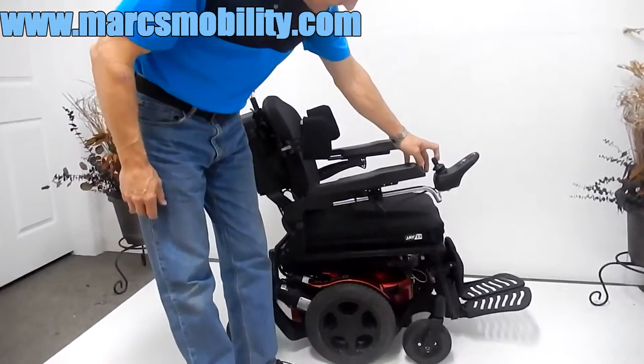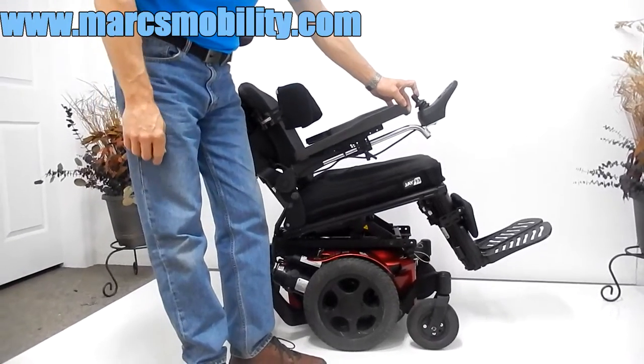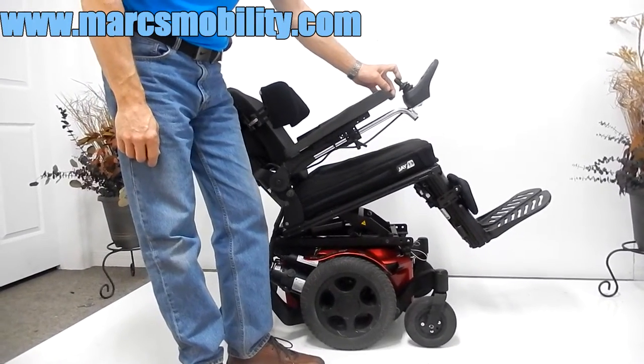So this would be your electric tilt. Very nice tilt on it.